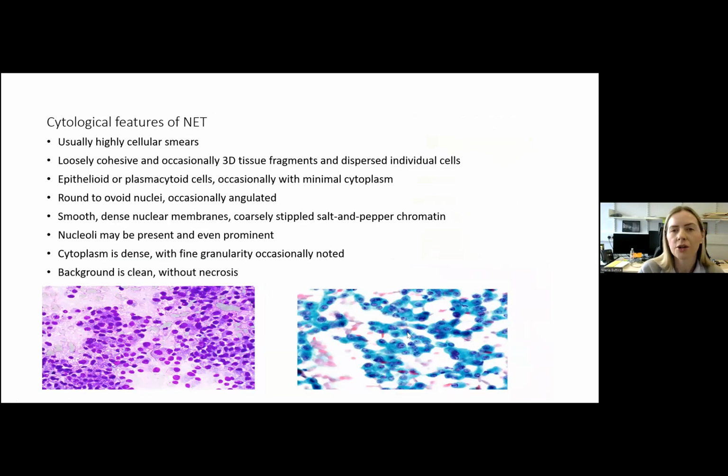I'd like to just show you an example of a neuroendocrine tumour, because these may often be incidental findings as a result of a patient being investigated for other reasons, and then they find a PET positive lesion in the body or tail of the pancreas, which undergoes FNAB.